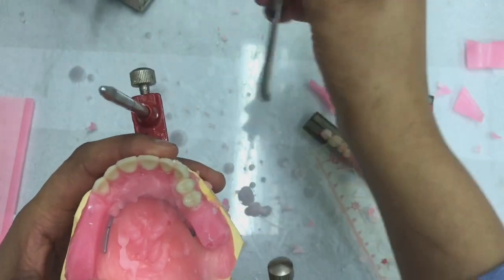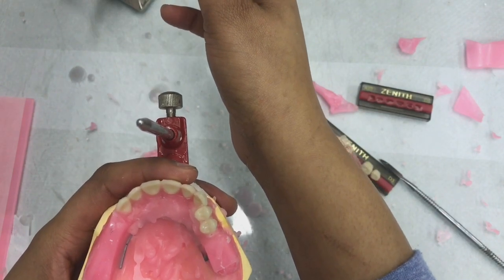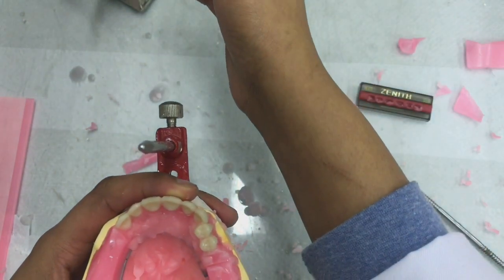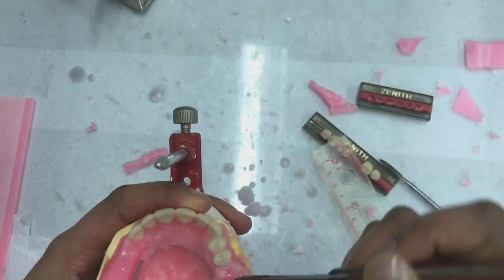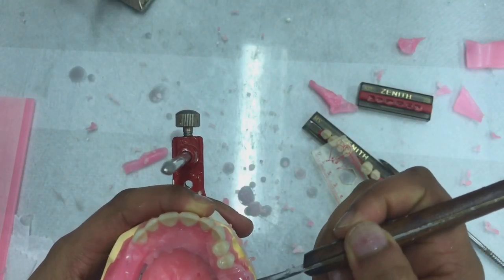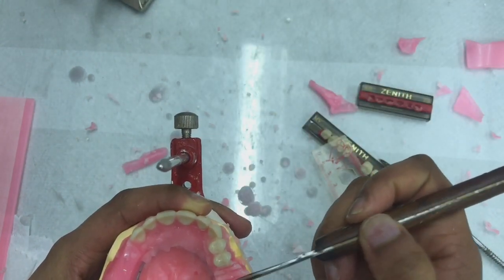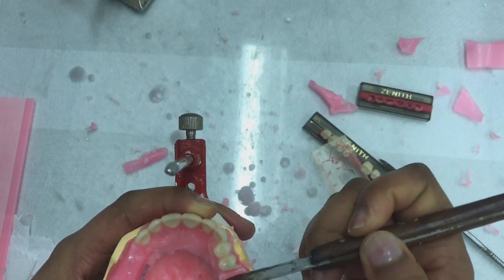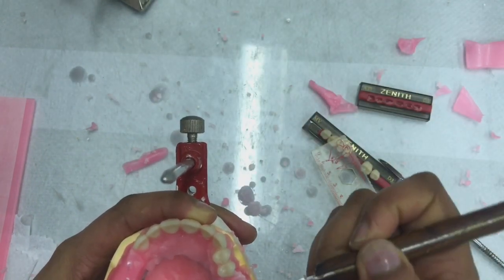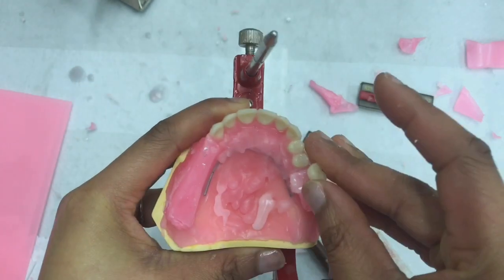So I'm happy. So now I'm going to position my first molar. Now this is where the curve of Spee starts to take form or take a visible form. So what is going to happen when I'm placing my tooth is I'm going to try and achieve for the mesiolingual cusp to be on the table, whilst all the other cusps will be off the table, and there is going to be a slight inclination of the cusp. So you're going to see this when I'm placing the tooth.